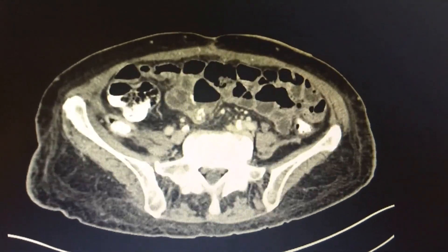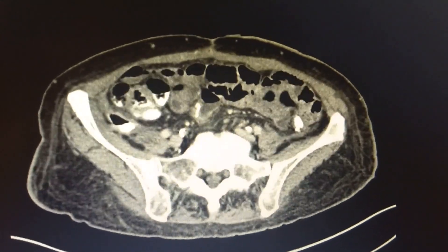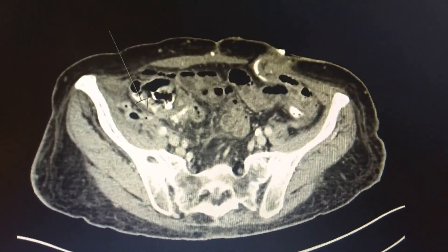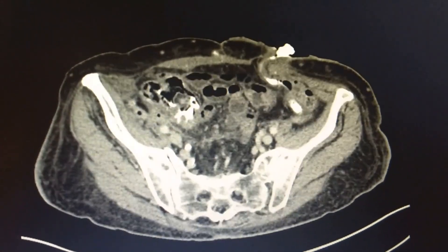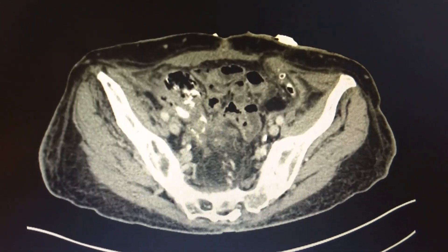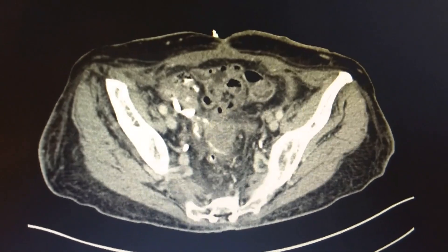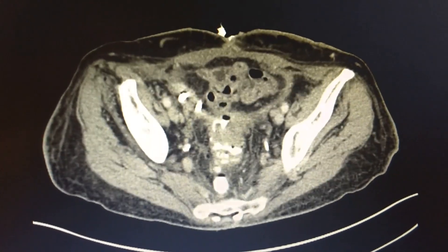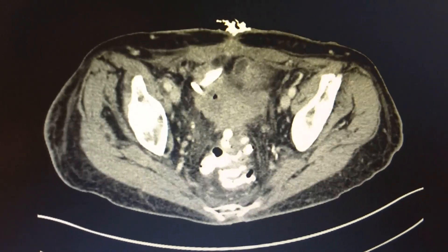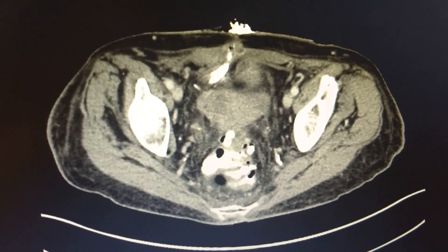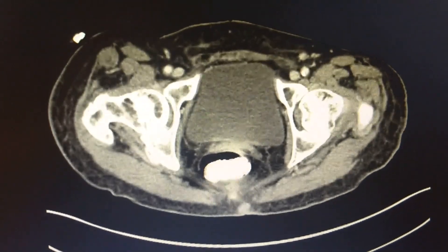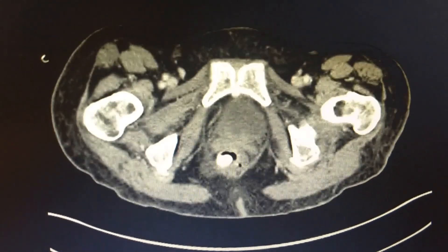Initial CT imaging with IV contrast and gastrografin injected into the right lower quadrant drain was performed. This demonstrated contrast filling a right lower quadrant abscess as well as contrast filling the Hartmann's pouch and the ascending colon. These findings were consistent with a colocutaneous, rectocutaneous, and colorectal fistula. We felt that the cecal involvement was likely iatrogenic due to one of her many right lower quadrant drain placements.